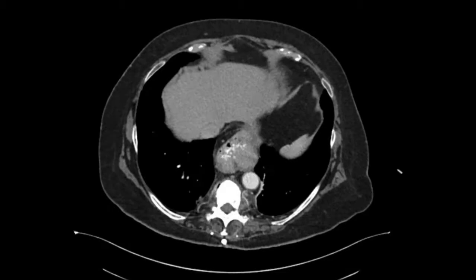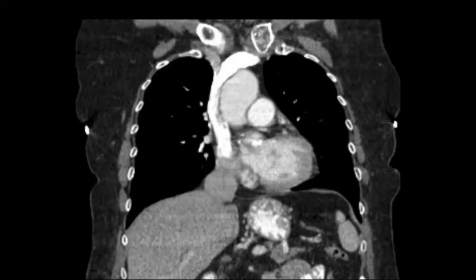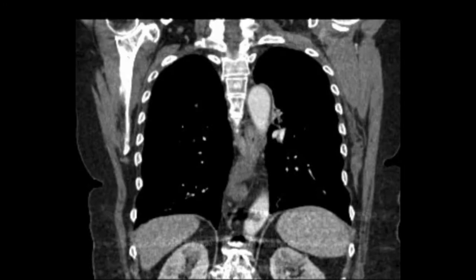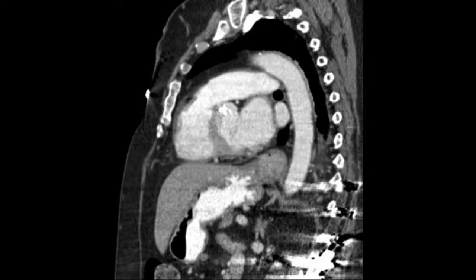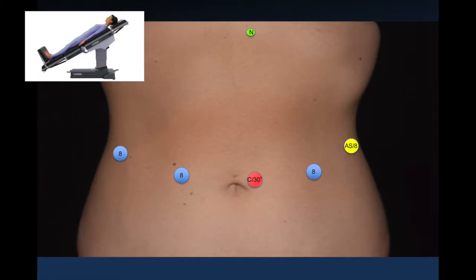The patient is an elderly woman with a classic type 3 paraesophageal hernia with severe symptoms. You can see on the coronal cuts where the fundus and the GE junction are situated above the diaphragm, and here are the sagittal cuts — there you see the GE junction. She has regurgitation and reflux, so she definitely needs this fixed.